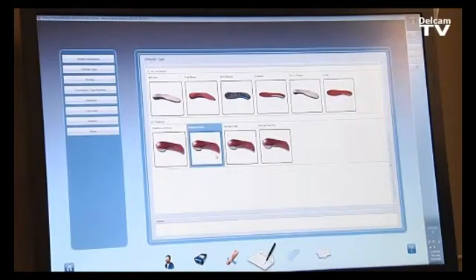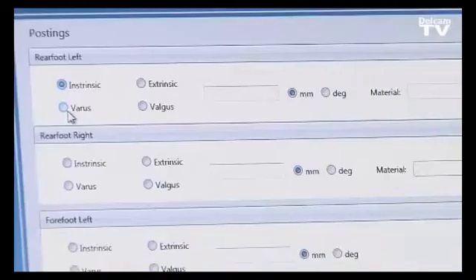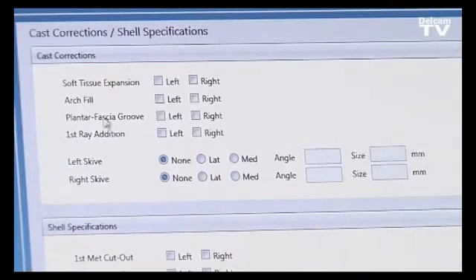We select the posting we want. The rear foot posting can be controlled independently from the forefoot posting — for example, we can add intrinsic varus in millimeters or degrees, and we can also add a valgus extrinsic posting on the rear foot. Corrections such as an arch fill, a plantar fascial groove, or a Kirby skive can all be selected by the doctor before the scan is sent to the lab.